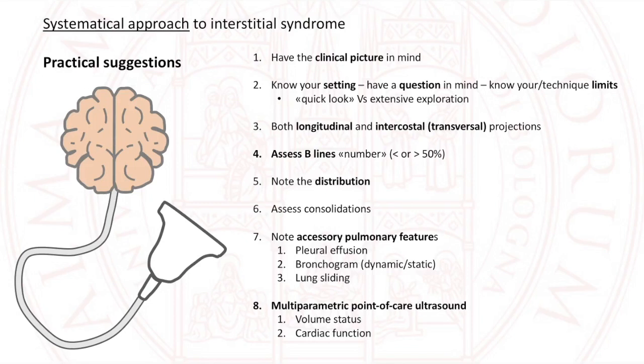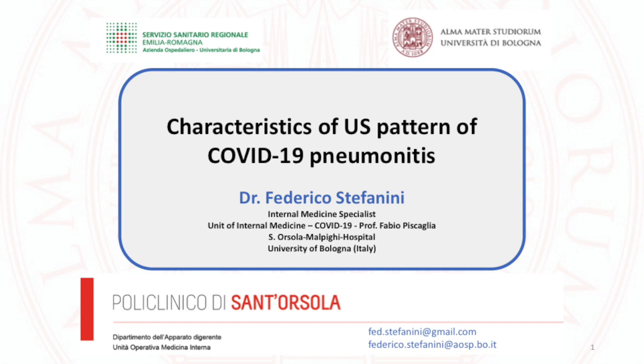So that will be all for the introduction. The next chapter will try to cover some of the characteristics of US patterns in COVID-19 pneumonitis, which we could assess by ourselves during these weeks in the hospital at the COVID-19 dedicated ward.